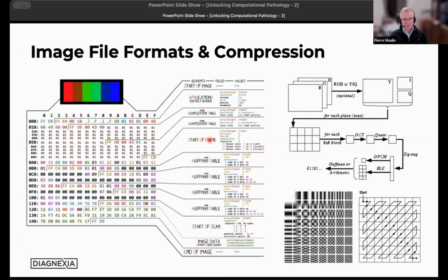And it's not straightforward to represent a square with X and Y coordinates, more so multiple of these squares or rectangles, multiple of these layers, in a linear file as it's written on disk.